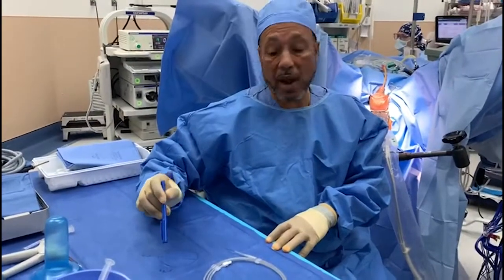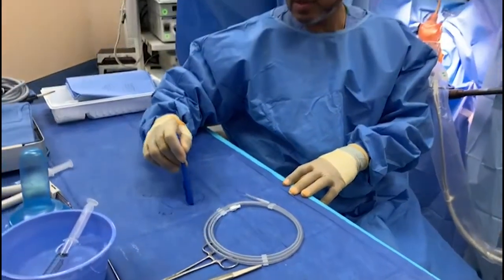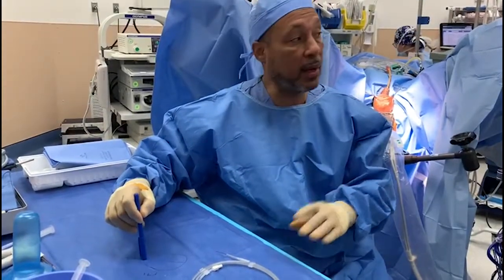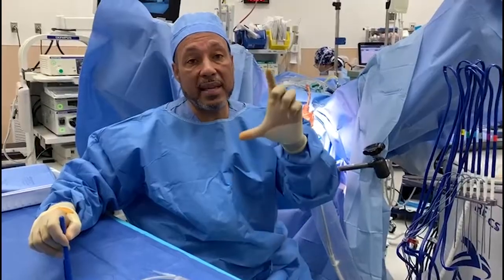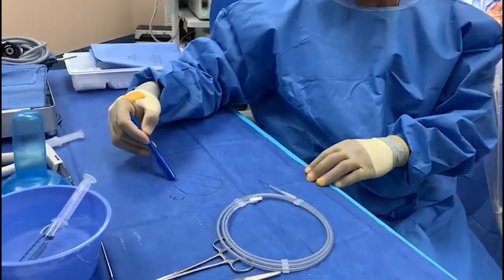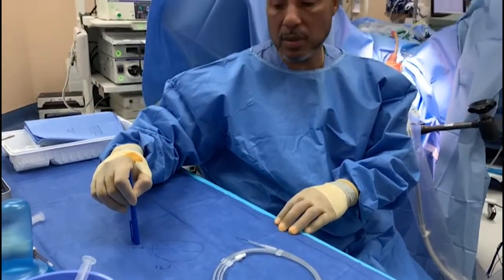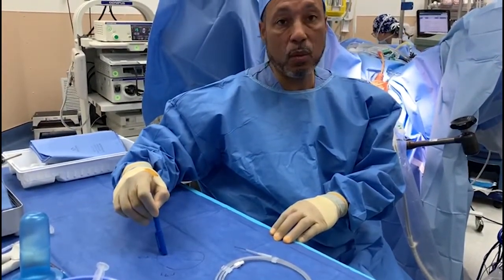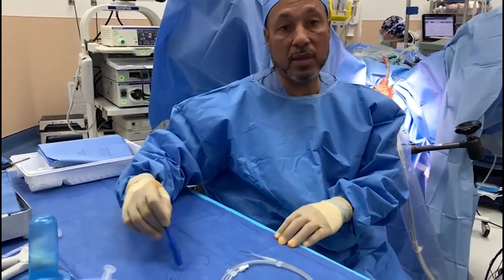We do a measurement of the prostate and he's 59 grams. In the sagittal section, I use variable probes for my cryotherapy. What I like about this Endocare system is that it has variable adjustable probes. I do my length measurement and it's five centimeters and 59 grams. Then we'll do my posterior lengths once the probes are in to make sure we're at the exact length to freeze the entire prostate.